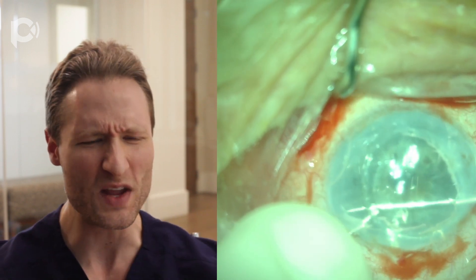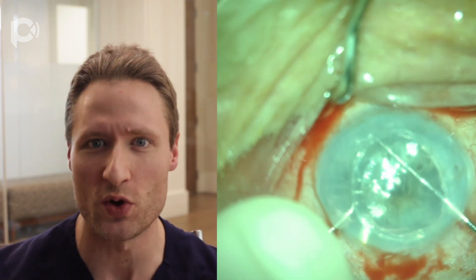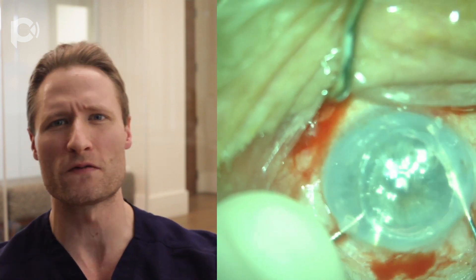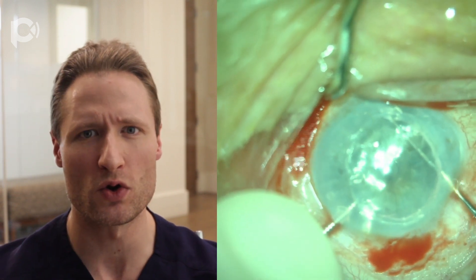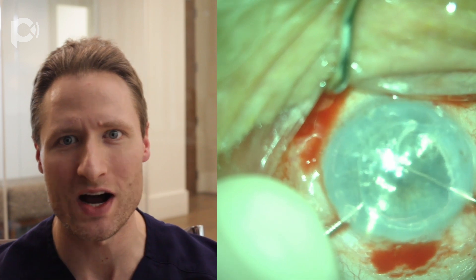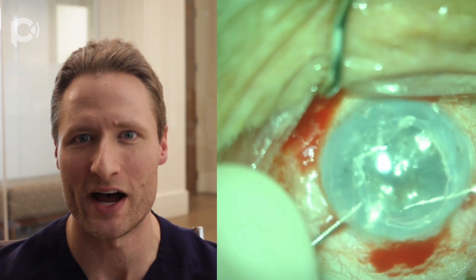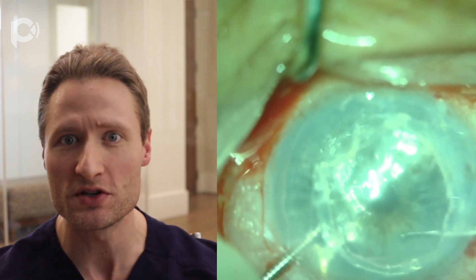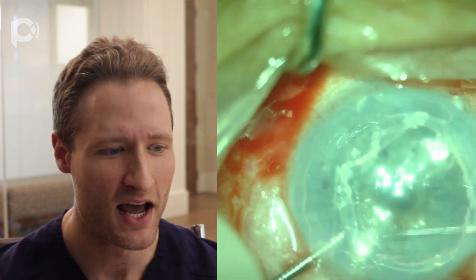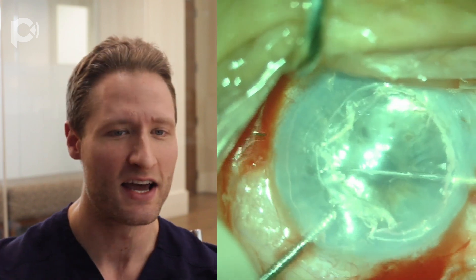This particular patient also has a prior DSEK, and this DSEK is living — it is a viable, alive endothelial graft — but it's a little bit temporally decentered, and at the interface it's just a little bit hazier than a normal cornea. This patient came to us with complaints about the quality of his vision, and hoping to improve how well he was able to function, we thought to replace this DSEK graft with a DMEK. If you're going to endeavor to do such a thing — replace a living, functional, healthy endothelial graft — you need to be quite confident in your ability to pull off the surgery.